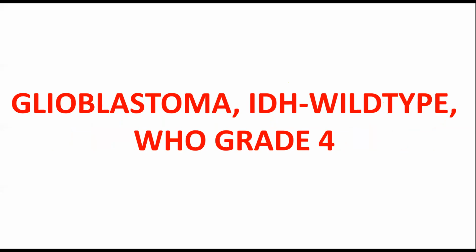All right. The diagnosis is glioblastoma, IDH wild type, WHO grade 4. Now, the first thing you may be saying is, wait a minute, this is a non-enhancing diffuse glioma. How can this be glioblastoma, IDH wild type, grade 4, just like that? Well, if you're thinking that, it's because you are unaware of the cIMPACT papers and what will be the new classification and grading system in the WHO 2020, the CNS 5E, the 5th edition. All right, let's run through it.